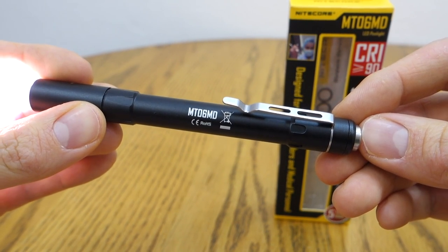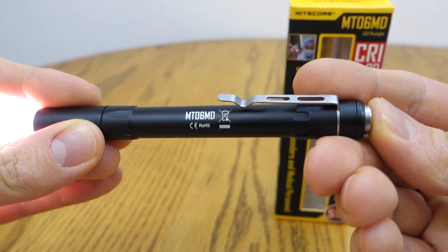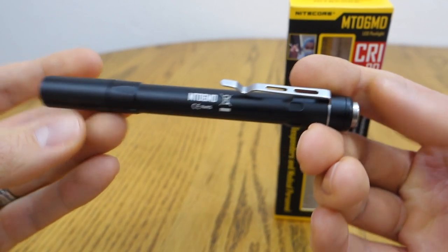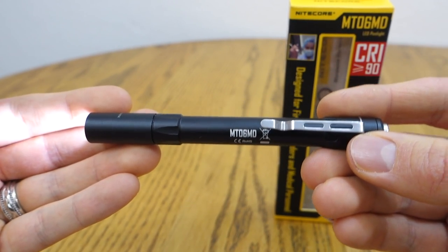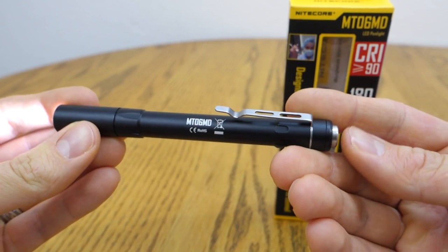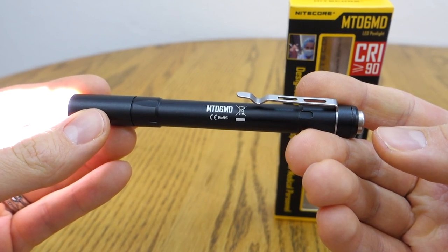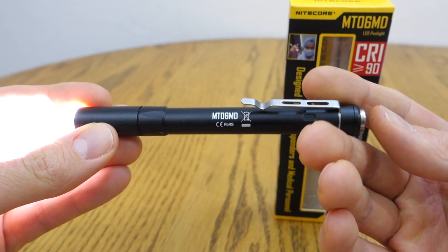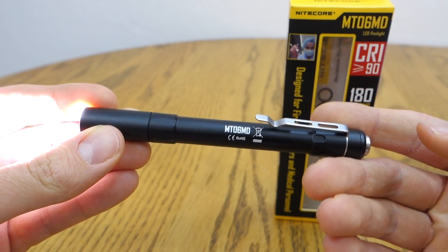The user interface uses a single button operation — just a single click, and it has a half press as well. From off, you give it a single full push and it turns on into a low mode, which is 4 lumens. Give it a half press and it escalates to mid mode, which is 45 lumens. Give it a half tap again and that goes into high, which is 180 lumens.